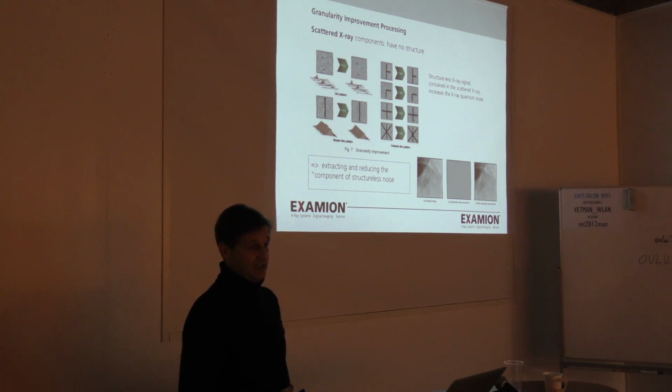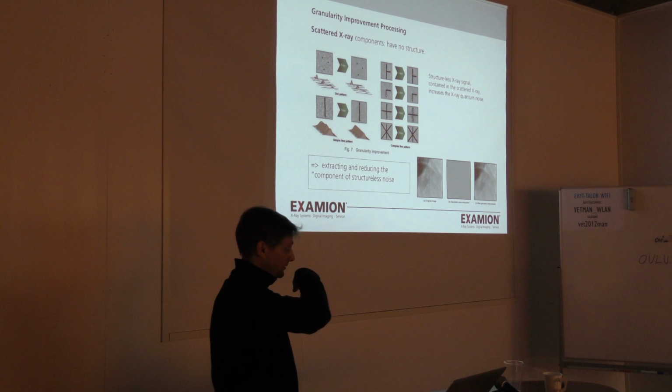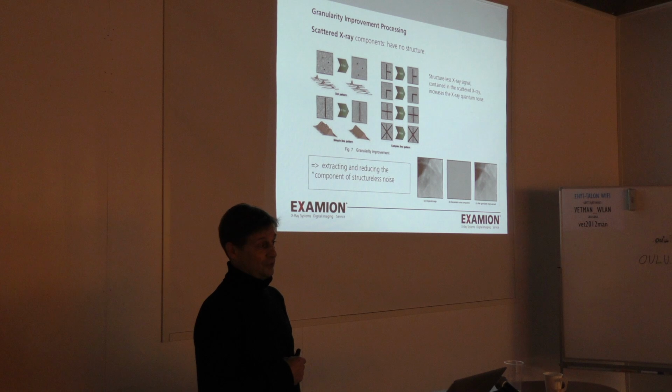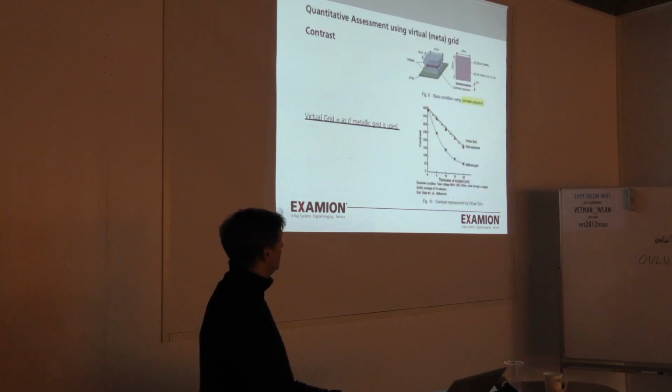In some cases, because of these algorithms, we are even able to diminish the X-ray dose needed, okay? Which is always a good thing, because you create less scattering radiation in the first place. You will also have shorter exposure times, so less blurriness. So overall, it's a better thing to do.